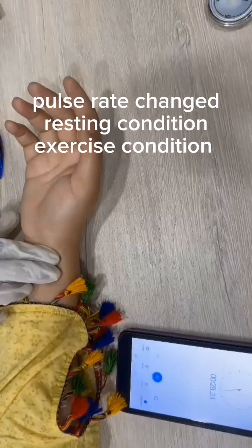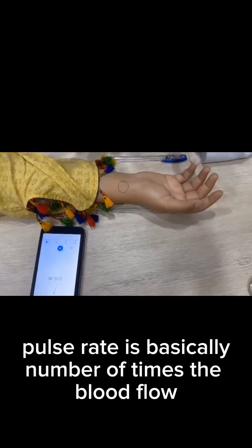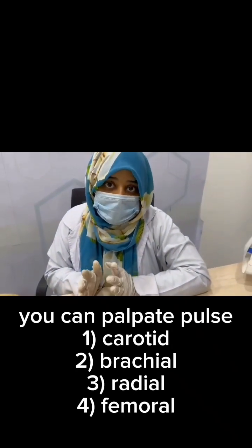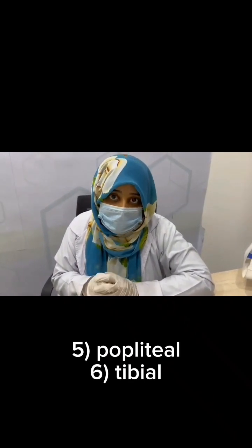You can also check the flow of the pulse, whether it is faster or slower, and whether the blood is flowing smoothly. Pulse rate is basically the number of times the blood flows. We can take the pulse from the carotid, brachial, radial, femoral, popliteal and tibial arteries.